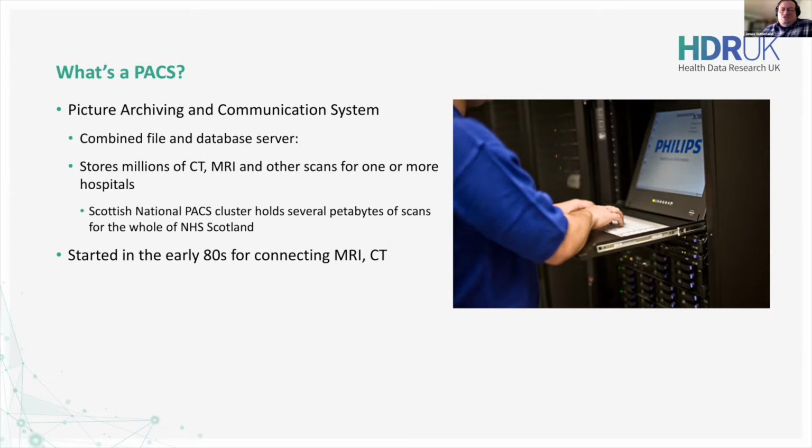And of course, MRI scanners, CT scanners are inherently electronic. So there had to be a computer involved somewhere. So the early ones were, I think, just standalone devices that did their own thing. And fairly early on, there was a recognition in healthcare and manufacturing that this wasn't really the best way to do things, that they needed some sort of server to tie everything together and organize it all better. And in particular, provide commonality between MRI scans and CT scans.